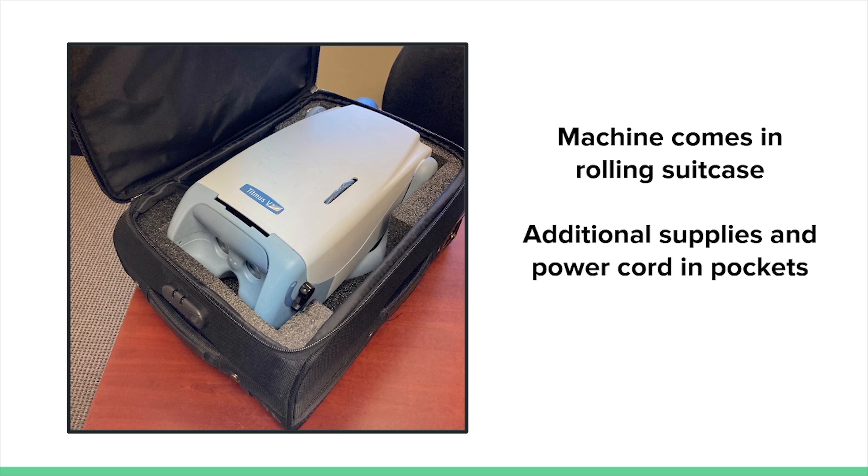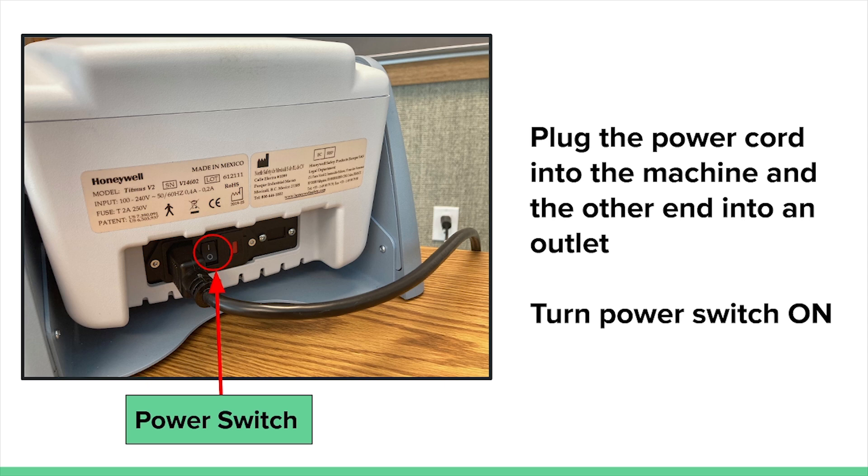Each machine comes in a padded rolling suitcase. Inside the pockets of the suitcase, you'll find the power cord and additional supplies to use during the screening process. To set up, place the machine on a table and plug the power cord into the base of the machine. Plug the other end into an outlet. Turn on the machine by pressing the power switch located near the cord at the base. Position the base so that the control buttons along the leg of the machine will be within arm's reach of the person conducting the screening.